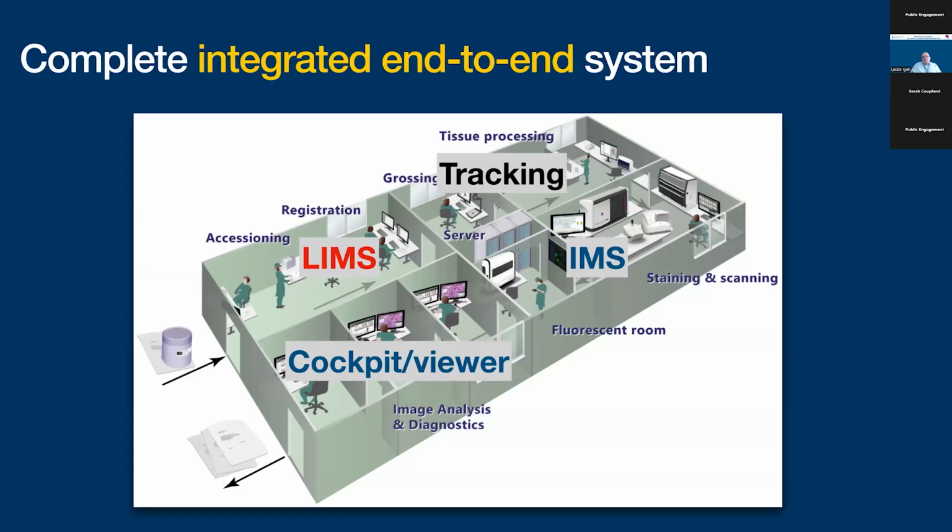We went through all of these things, and the important message from all this is you have to have an integrated end-to-end system. This is currently a wishful dream. Nobody does a complete system for pathology because the LIMS suppliers are not venturing into IMS or creating cockpits, and tracking is a completely different business. LIMS and tracking probably merge slightly more, and the IMS companies are not into laboratory information management systems whatsoever.